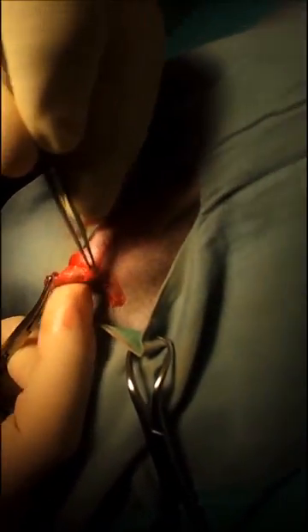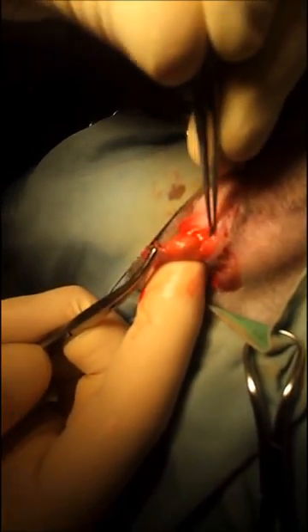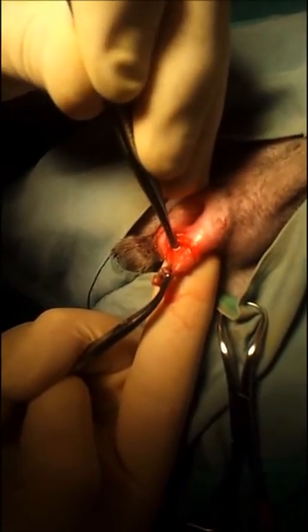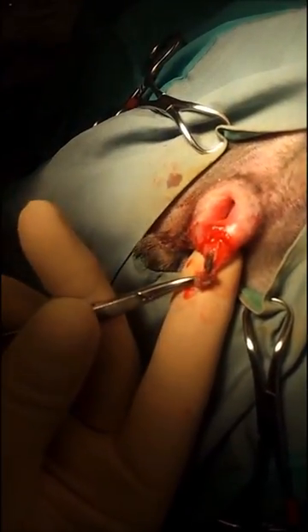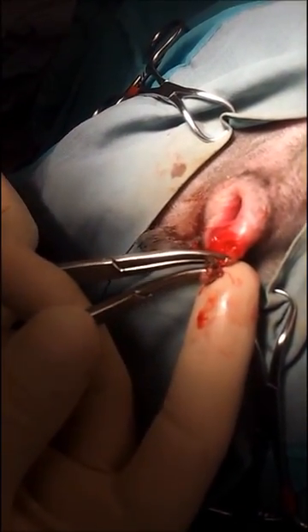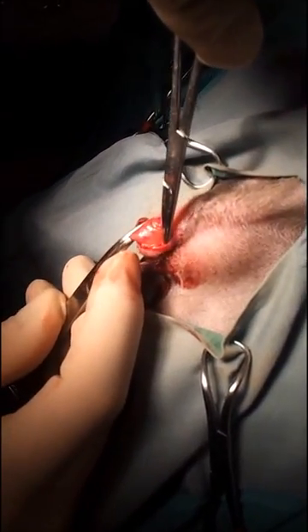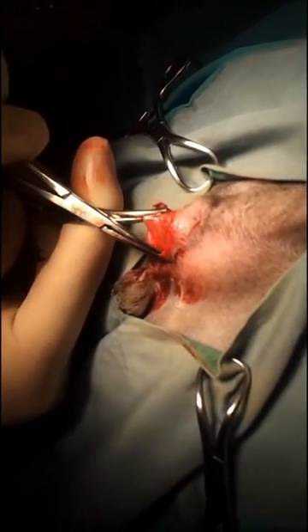Here's an example of where I'm getting a little too close to the inner lining of the sac — right there it's a little dark colored, so I'm going to back off at that point. Here is striated muscle — I can pull that away back to the animal. There's an example of it starting to rip right there, and that's okay. Not all is lost — all you do is grab below the rip and you're good to go. Here's the gland tissue right there, a little darker than you'd expect, meaning you're getting fairly thin tissue around there.